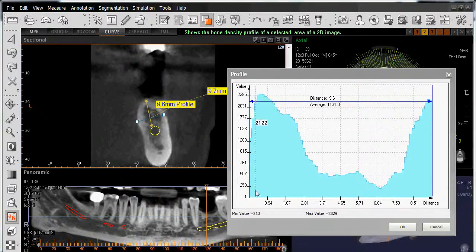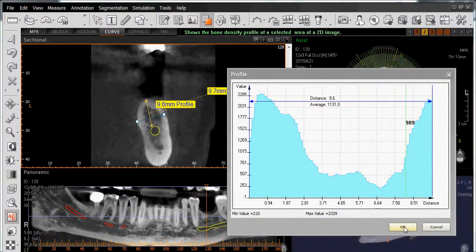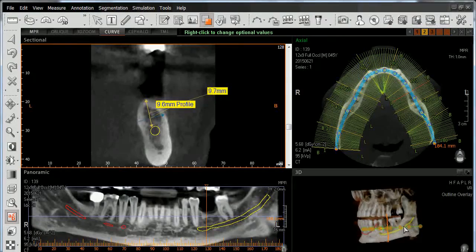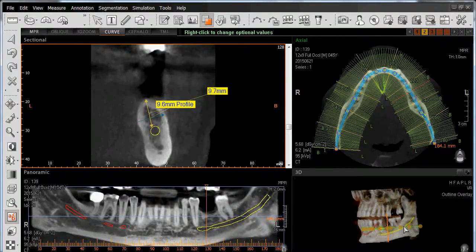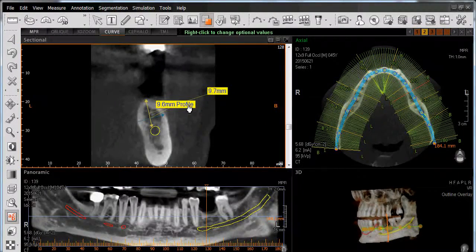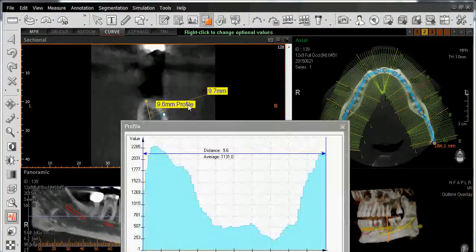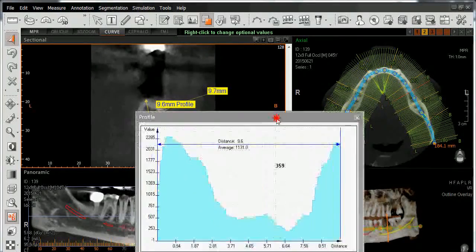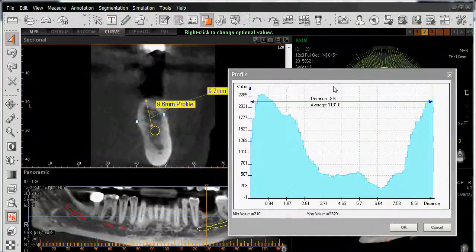Once we've verified and assessed our bone quality using the profile tool, simply left-click OK to close the window. To access that window again, simply double-click on the word 'profile' and you'll see the window appear again, giving us the same information as before.